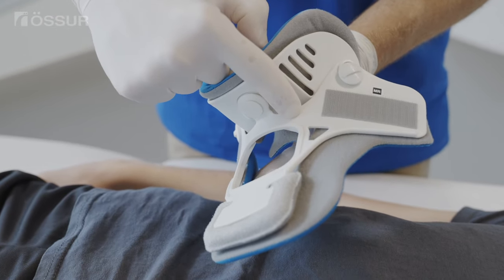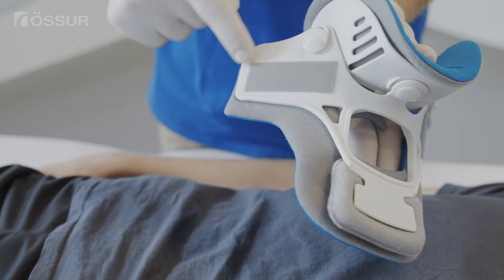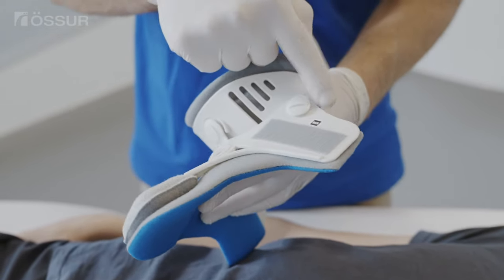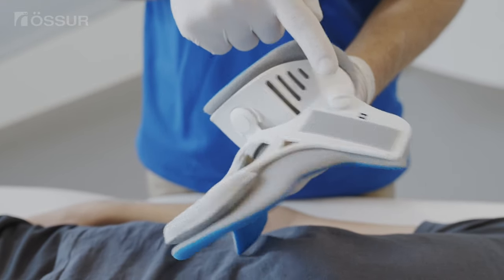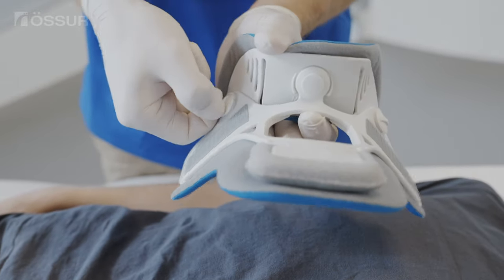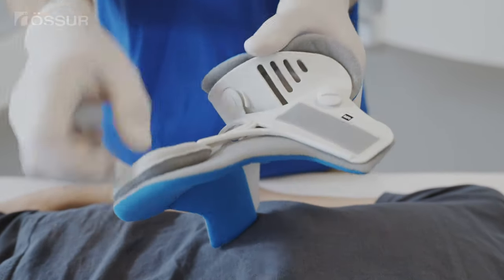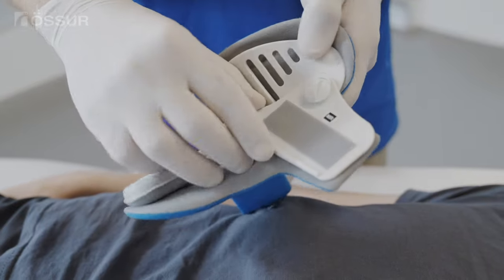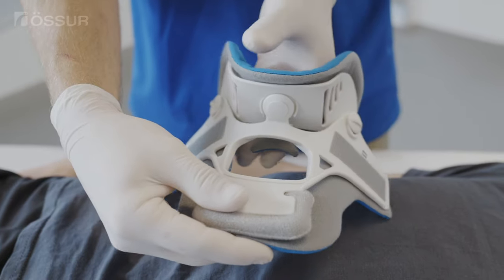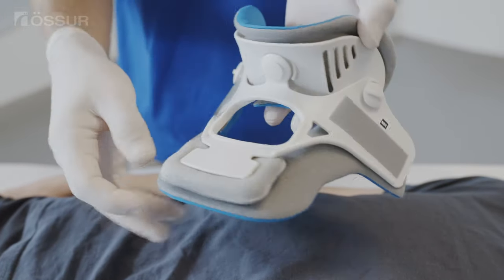Note the arrow on the panel pointing up. Ensure the Sorbitex padding extends beyond the edge of the plastic. Angulation buttons may be used to fine tune the fit of the collar for better anatomical conformity, pressure distribution, and comfort of the chin support. Unlock and slide up and lock to relieve chin tip pressure or discomfort. Slide down to relieve jaw or mandibular pressure or discomfort.